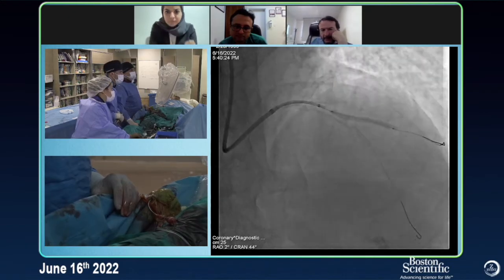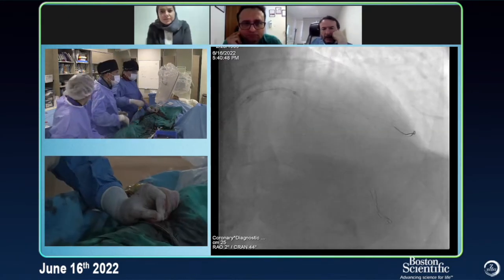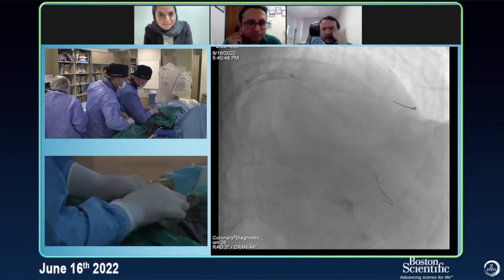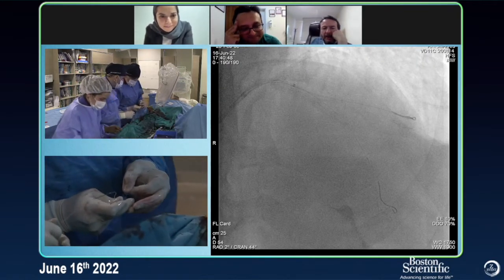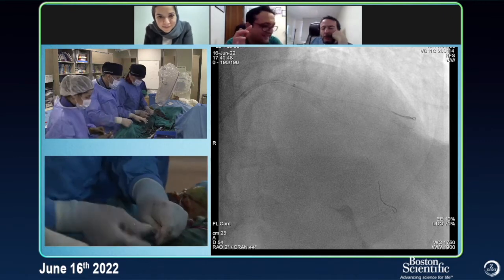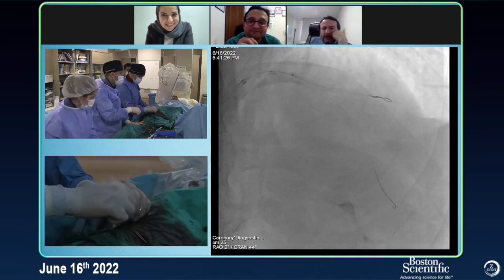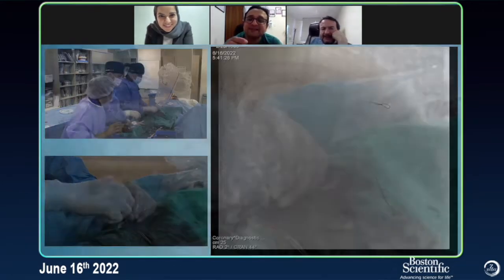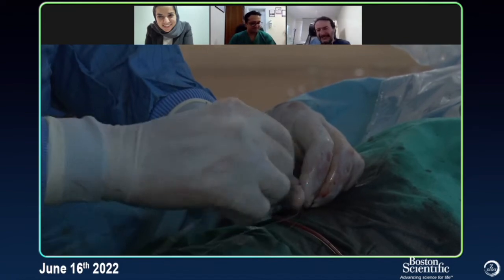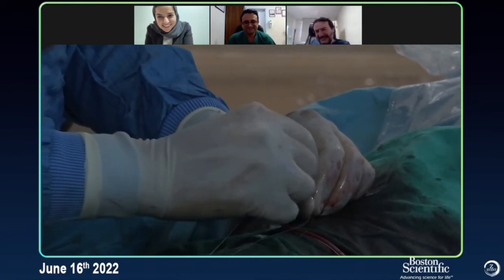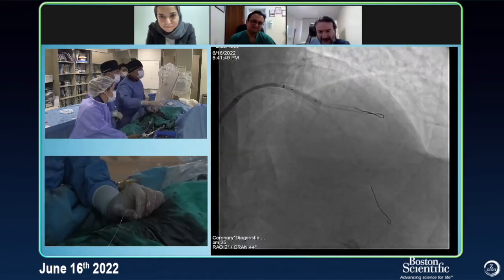3.5 for POT. Opening is okay, done. I'll remove this diagonal wire and I like to recross it with this wire. That's important — I follow the true lumen. That's why we shouldn't use a hydrophilic wire here.